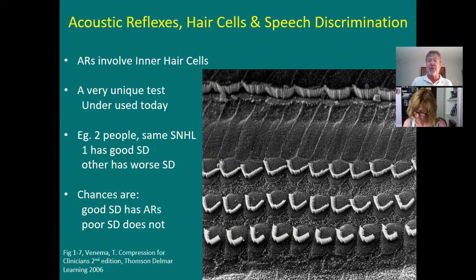So to summarize here, look at my slide, it's black now. That means we're done. Otitis media: negative tympanogram, absent acoustic reflexes. Otosclerosis: stiff tympanogram, AS, short. It'll be over 0, but it'll be squat, absent acoustic reflexes.